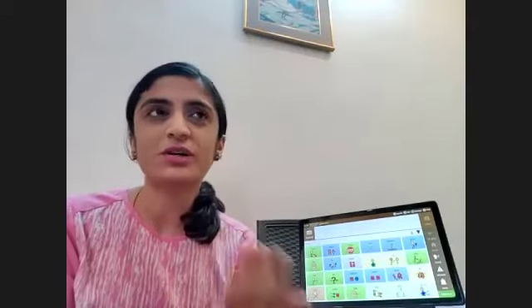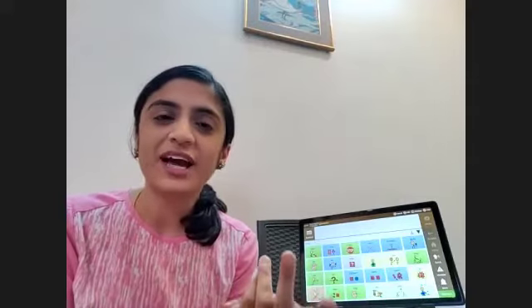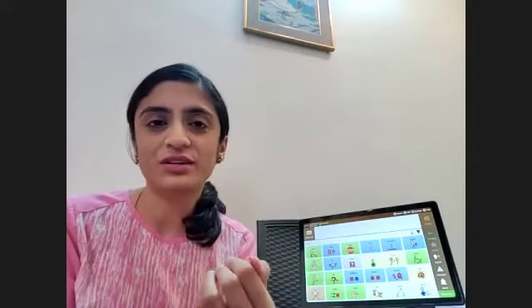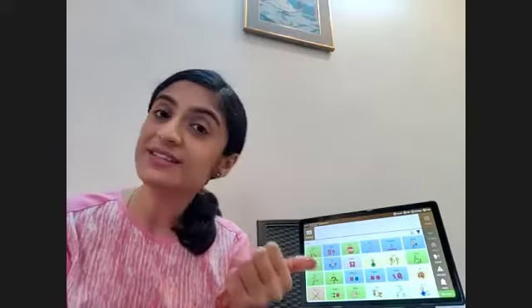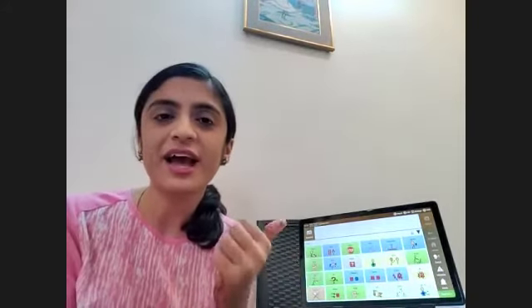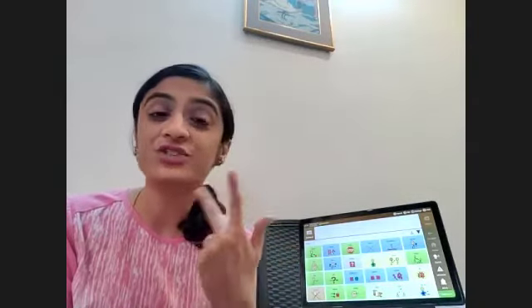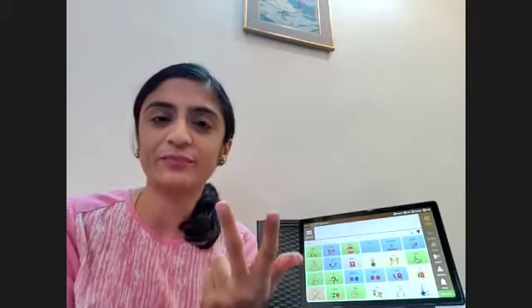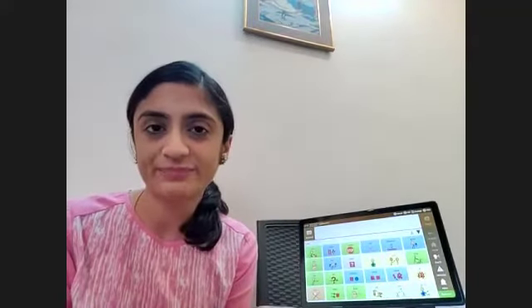So you could have just modeled what are they eating? So that's one example. And if your Avaz user has lots of language and is really proficient, you can model more sentences like I did. And you can even ask questions, and you can even encourage them to ask questions about the book. So you can change it depending on what level your Avaz user is at.